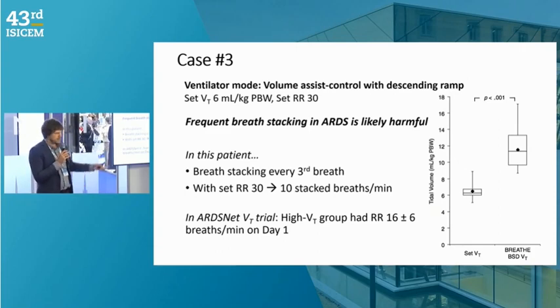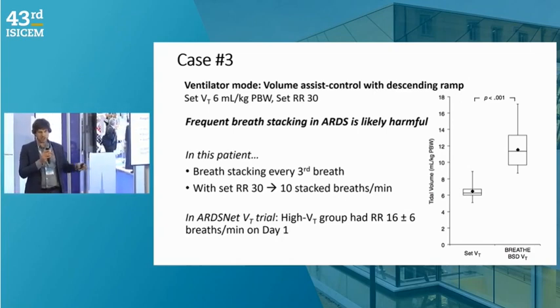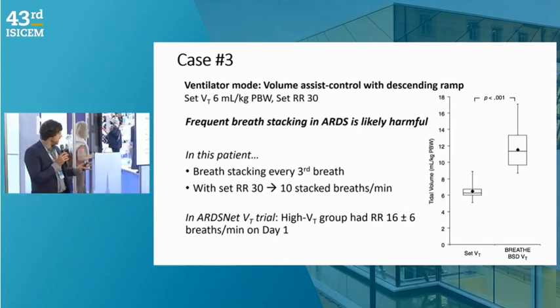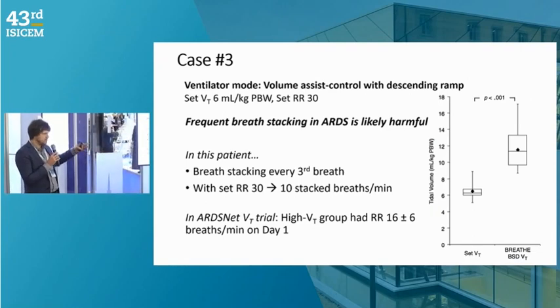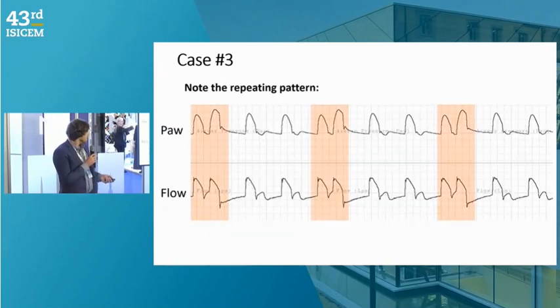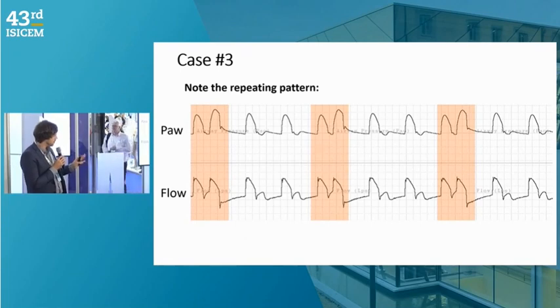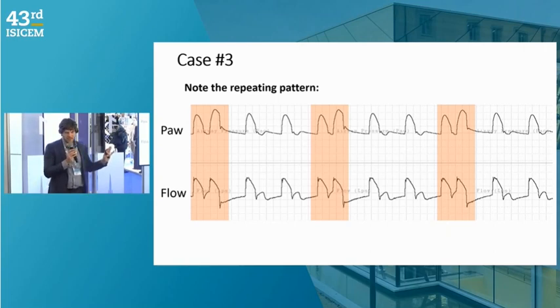So while we don't have definitive data in clinical trials that says this is harmful, it seems quite likely from our understanding of the literature that if they're doing it often enough, 10, 15, 20 times a minute, that's quite likely to be harmful. And so this particular form of breath stacking is something called reverse triggering or entrainment. And I think oftentimes when people present this, it's hard even for me to follow, and I don't think it needs to be that way. So one of the classic clues to something being reverse triggering or entrainment is that it's a rhythm dysynchrony.